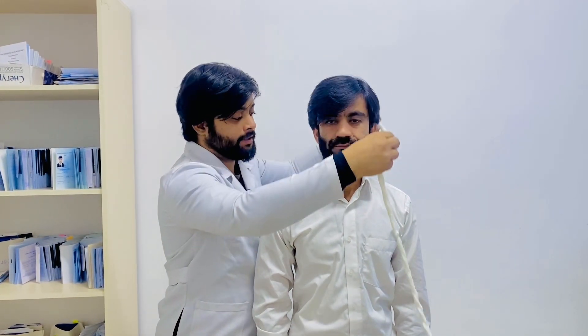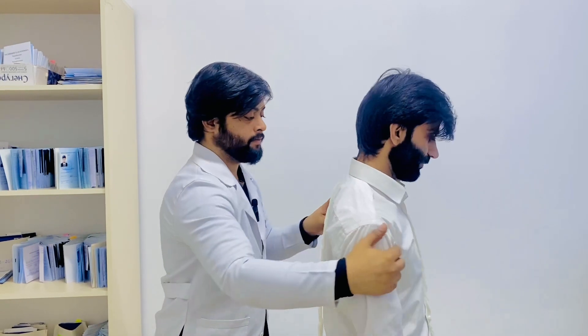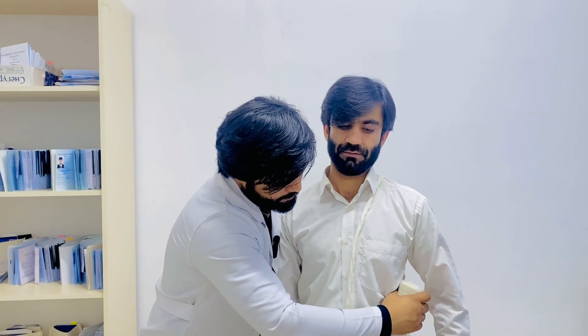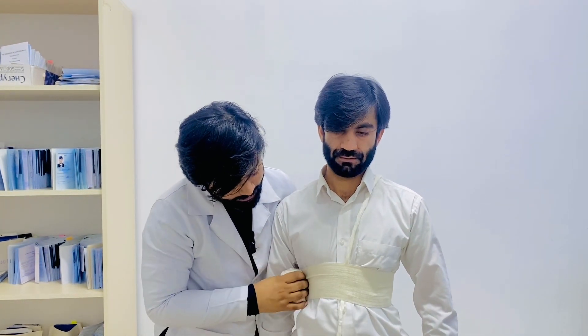Welcome back to Doctor Next Lectures. In this video we will talk about the spiral bandage to the thorax, also called the harness. First of all, we will position it here, then take a bandage and make two circulations from that side like this.